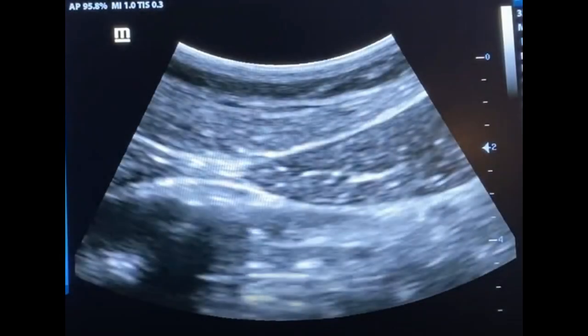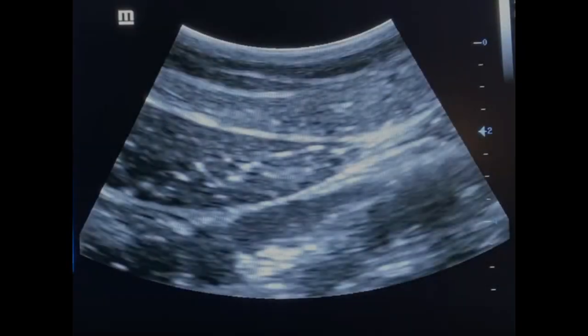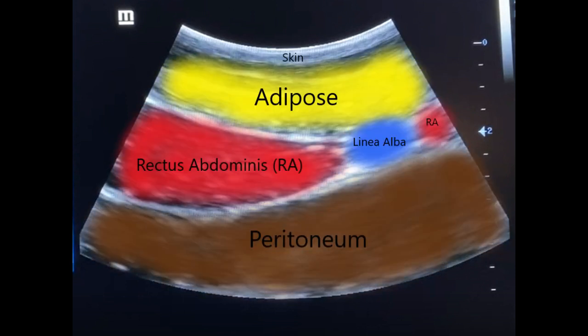Here's a frozen frame. You can see the rectus abdominis on the right side and the space in between — that's the linea alba. Now it makes a little more sense: you've got the skin, then the adipose tissue, the rectus abdominis highlighted in red, the linea alba in blue, and the other side of the rectus on the other side. Then the peritoneum is what's directly underneath the rectus abdominis, which is why it's so important to know your depth when you're needling this particular muscle. Here's a still image of the opposite side — same kind of image, just the other side — showing the skin, adipose, rectus abdominis, linea alba, and then most importantly the peritoneum directly underneath.